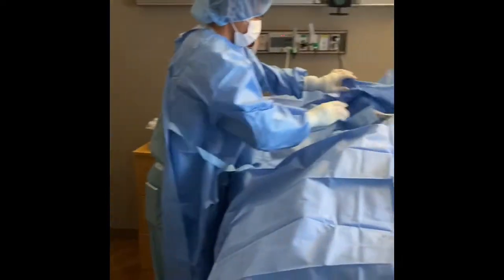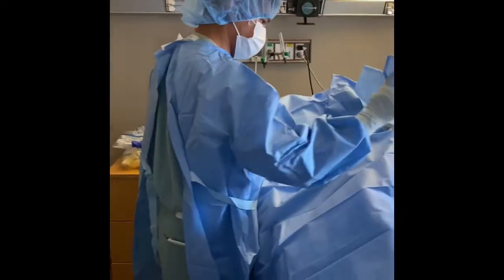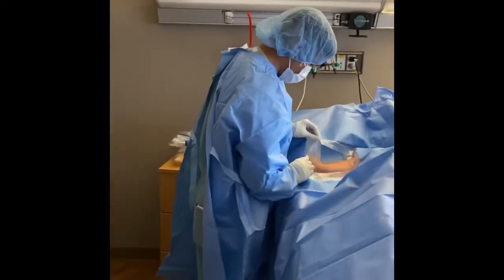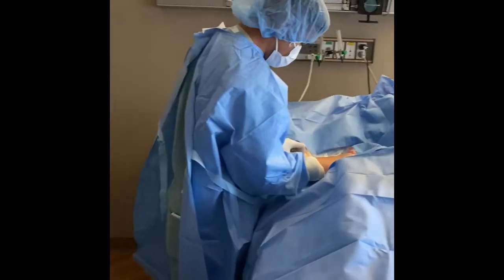Good afternoon guys. We are currently here doing a procedure. It's a midline procedure and the one who's doing it is John — he's my trainee today. He's doing the midline, and I'm training him.